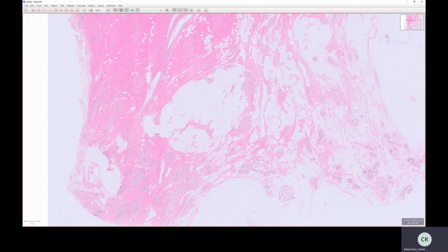And like in many areas, there are certain hallmarks of malignancy that you can identify within the cells that you look out for to decide whether they're malignant or not. And like in the prostate, the architecture is also useful. So at low power here, we can see this organoid architecture of glands, round glandular aggregates of the lobules and the ducts. And that's an organoid architecture that's organized, whereas if it was malignant, there would just be glands infiltrating every which way, and that would make you suspicious that you were dealing with malignancy, or invasive malignancy.